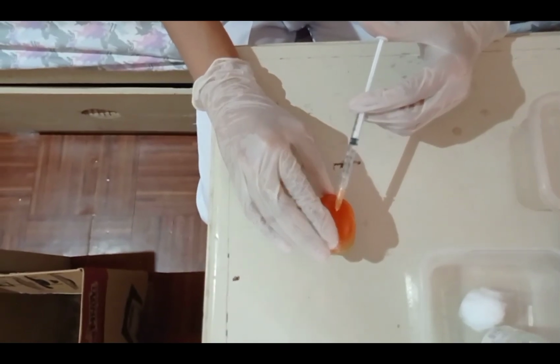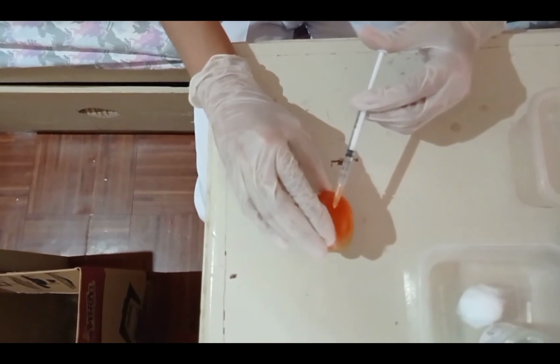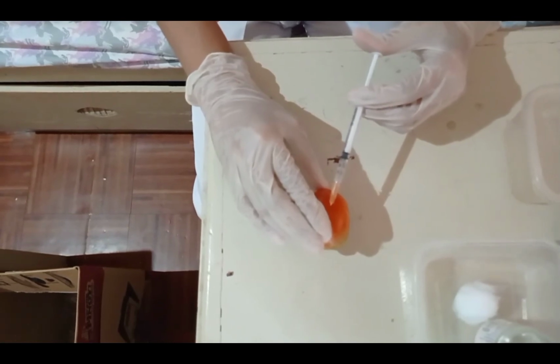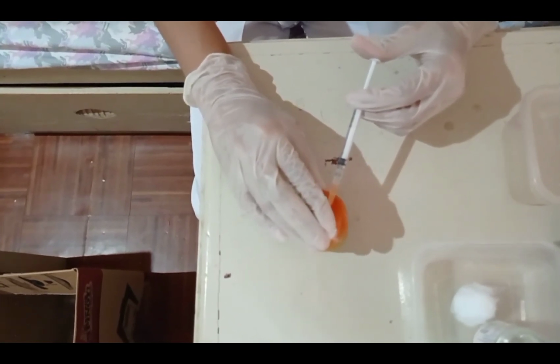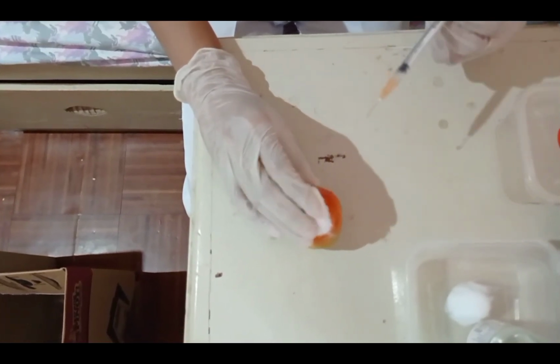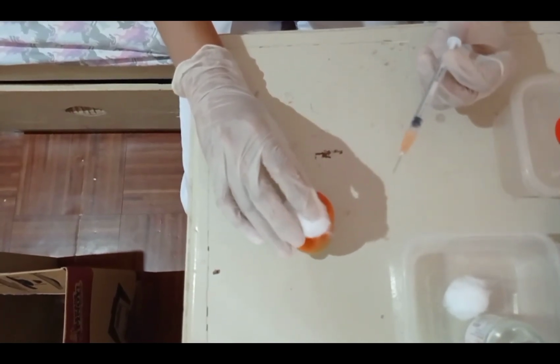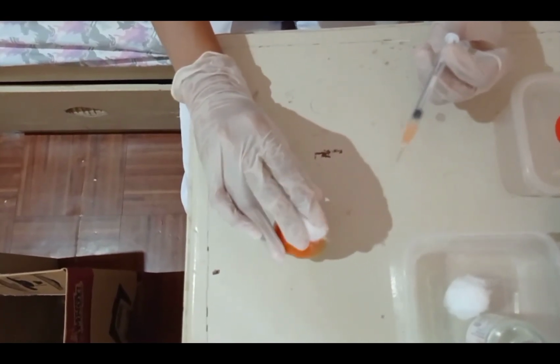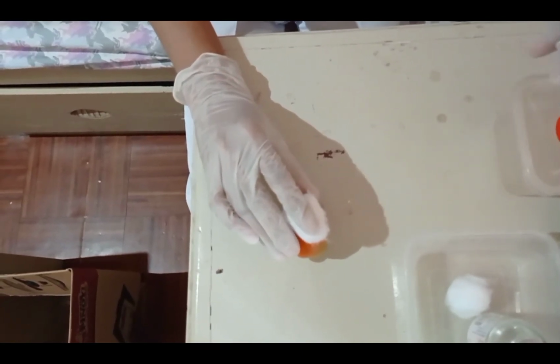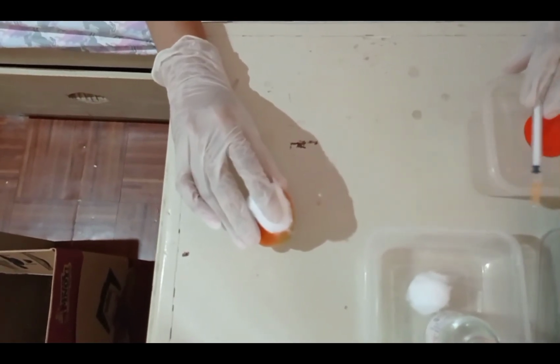We should avoid moving the syringe, and keeping the needle steady will help keep the needle in place. Then withdraw the needle quickly at the same angle at which it was inserted. Then using sterile gauze or cotton balls, apply gentle pressure at the site after the needle is withdrawn. We should not massage it because it is not necessary and can only damage underlying tissue.